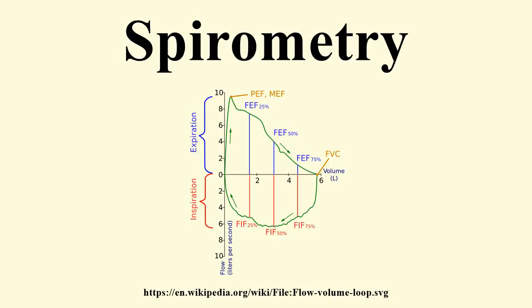Spirometry is the most common of the pulmonary function tests, measuring lung function, specifically the amount or speed of air that can be inhaled and exhaled. Spirometry is an important tool used for generating pneumotachographs, which are helpful in assessing conditions such as asthma, pulmonary fibrosis, cystic fibrosis, and COPD.